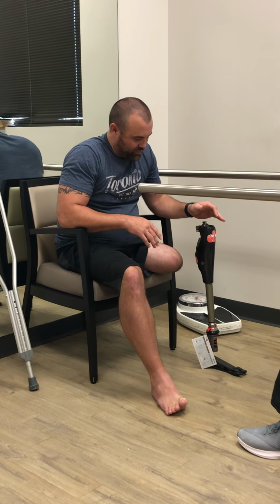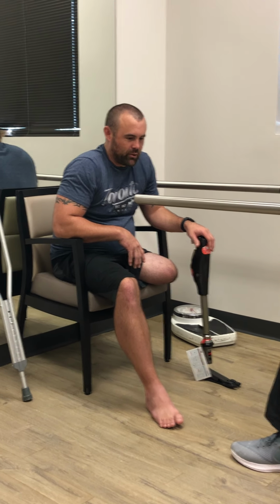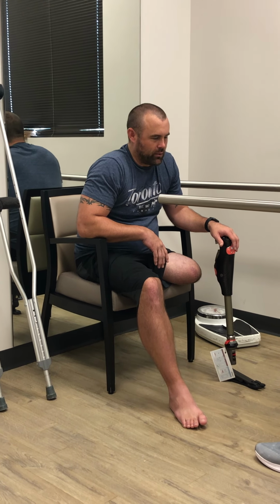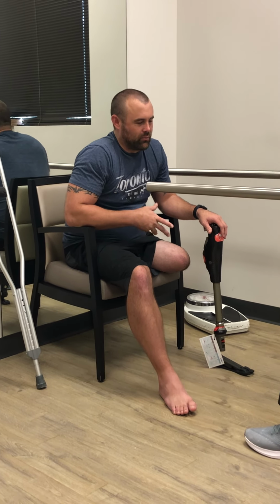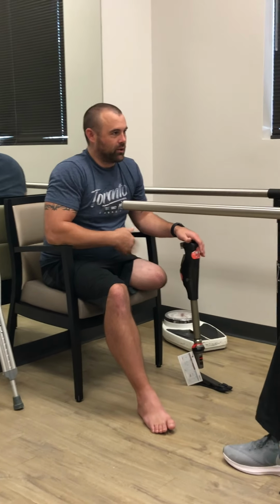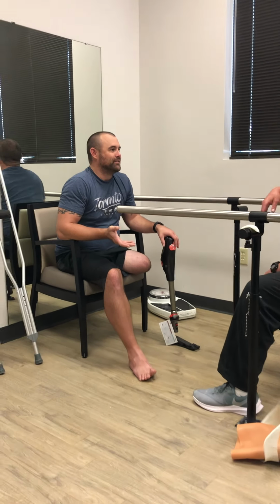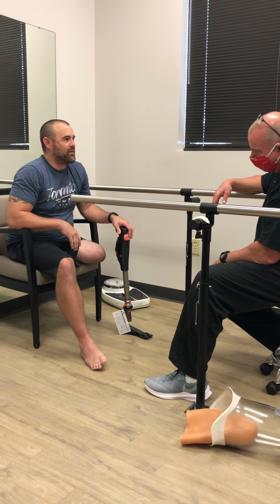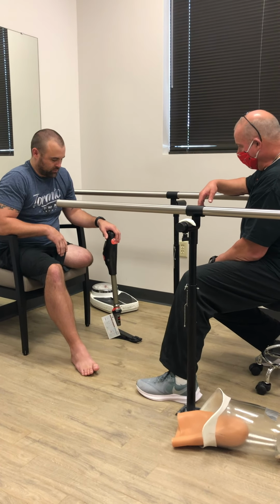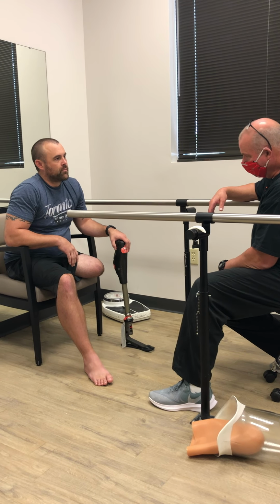I have a question that has nothing to do with this technically. One of my more pessimistic amputee friends was trying to explain pistoning and wanting to worry me about it. Pistoning on the socket? Yeah. No, I mean, some of that is socket fit, it can be the type of suspension you have.